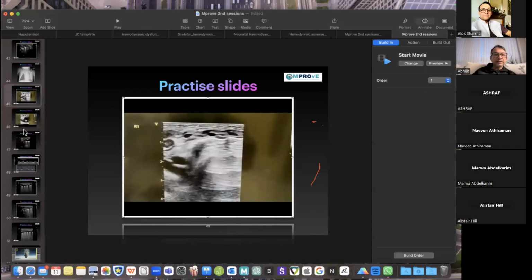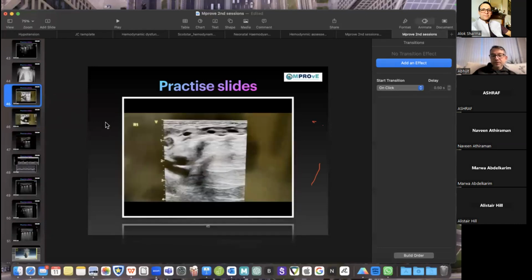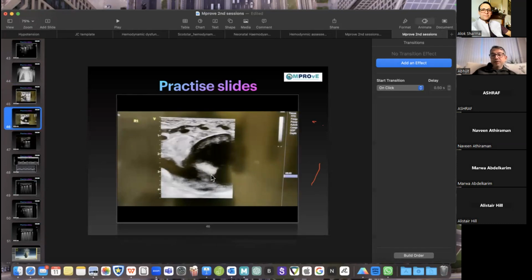Okay, I angle the probe because it doesn't go with my chest X-ray. So then I found this one. The lungs look normal. There is no, this is encapsulated. There is no broken pleural line. Well aerated lung. And it is sitting on top of the heart.